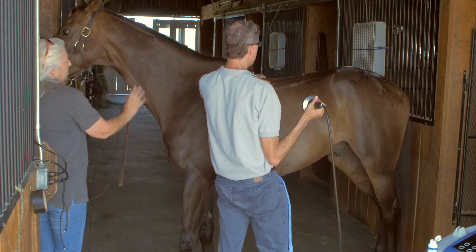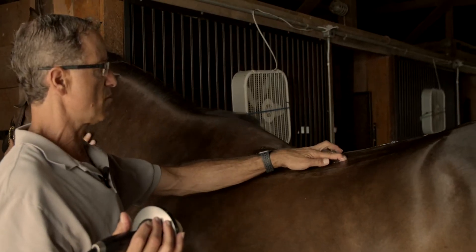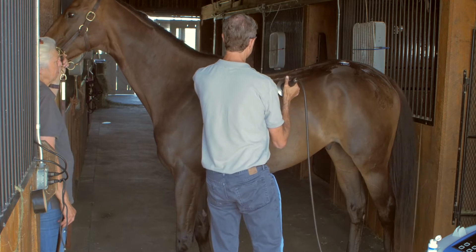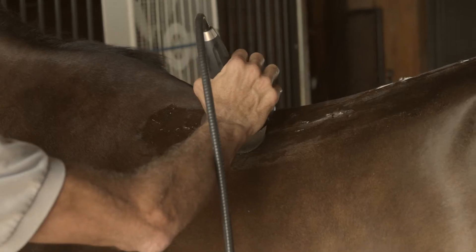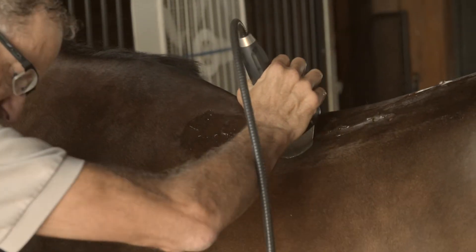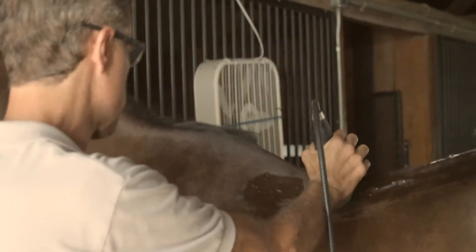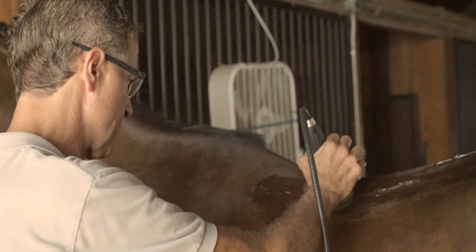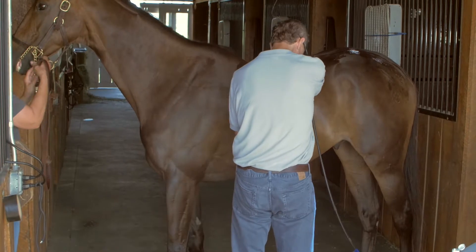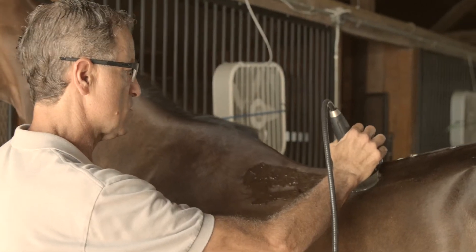Without him tranquilized, I can identify trigger points along this acupuncture meridian. It's really easy to find — you don't have to use a lot of pressure. He's tolerating this well so I'm going to go up in intensity. That's 15... 17. You can see that even at full power, he's tolerating this really well.